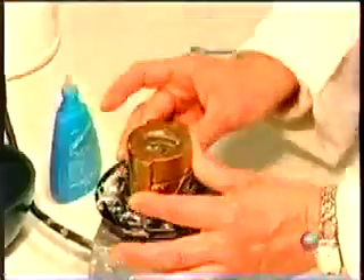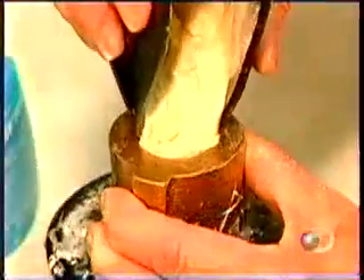They place the impression in a mold and pour in a type of plaster. When the plaster is hardened, they lock the mold into a press and submerge it in a high-pressure curing unit for 25 minutes. Then they cool the mold in cold water. Here's the original impression compared to the acrylic model they've just cast.